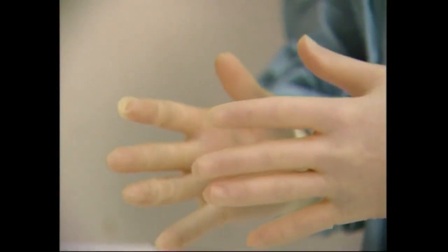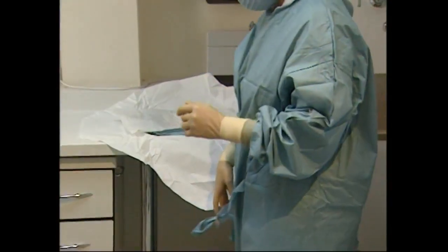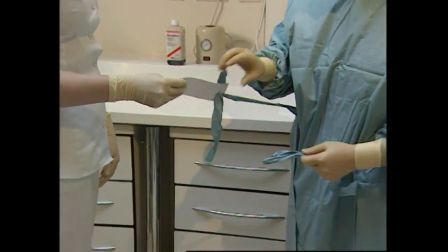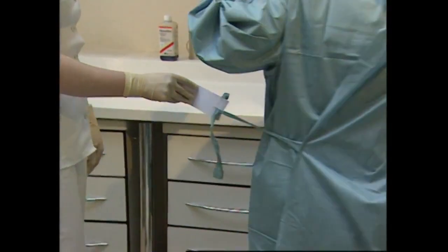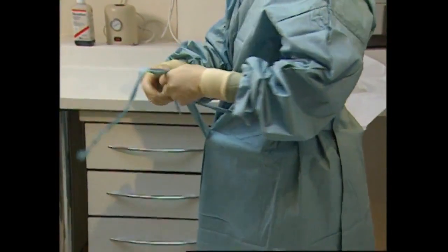The final tie of the gown is completed with the help of the roving assistant. The non-sterile end of the tag is pulled away from the tie and handed to the roving assistant. The surgical assistant turns through 360 degrees, holds the other sterile tie, pulling it out of the tag and completes tying the gown.